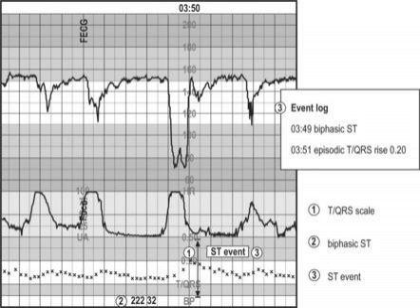Now I want to go back to their introduction and quote the objective. They wrote, quote, "Given the rarity of adverse outcomes in monitored fetuses, we chose to test for an improvement in fetal assessment by evaluating whether fetal pulse oximetry allows a significant and safe reduction in cesarean deliveries done because of non-reassuring fetal status. If the oximeter has greater specificity than electronic fetal heart rate monitoring to determine the absence of significant fetal hypoxia, the clinician might safely avoid unnecessary operative interventions for non-reassuring fetal heart rate patterns."